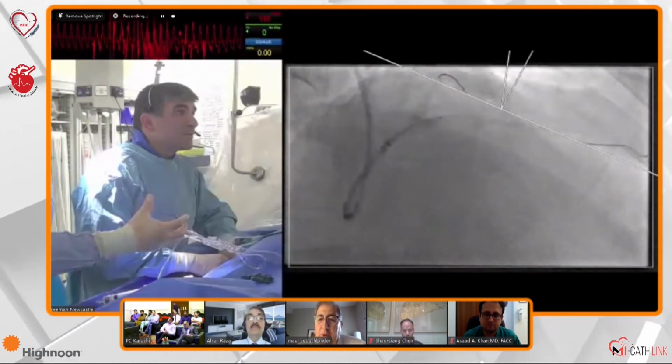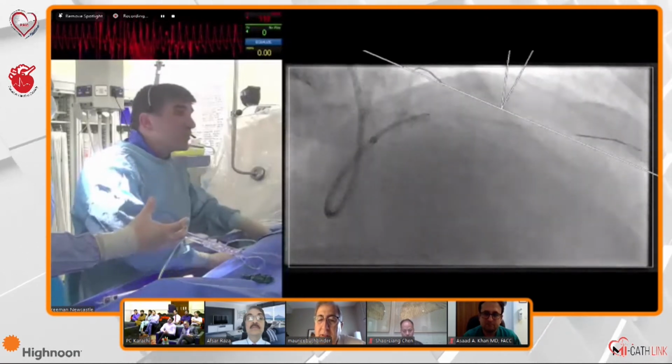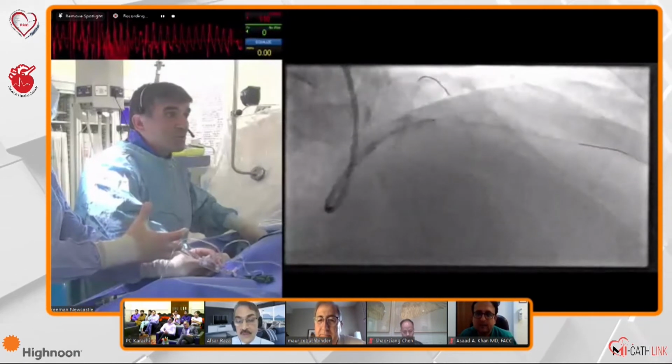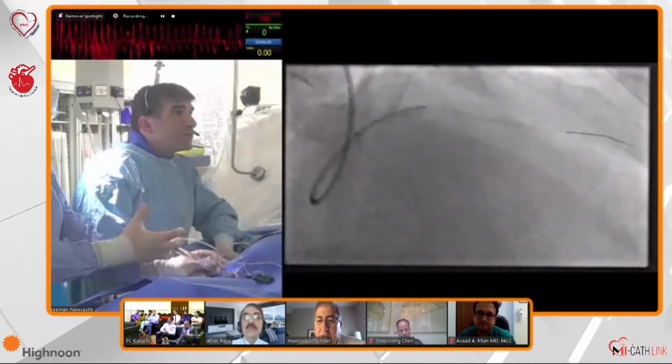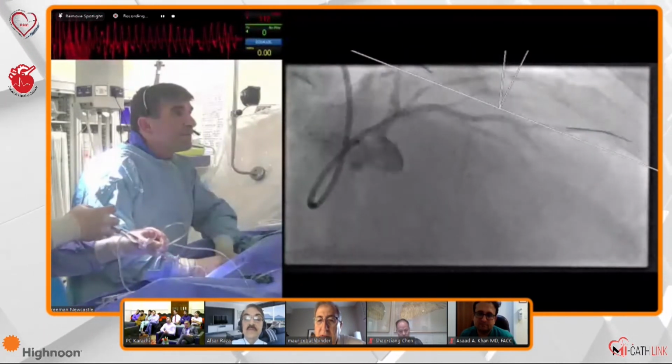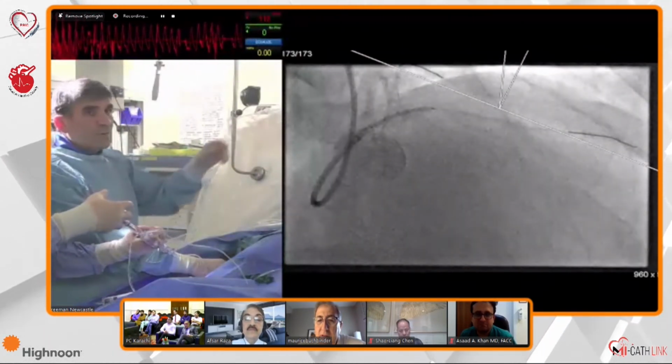So yes, I think absolutely, it's perfect to leave it by itself. Yeah, right there. Just one second. Make sure. So just going to push this. It might not be tested there. Okay, store that and go to AP cranial.